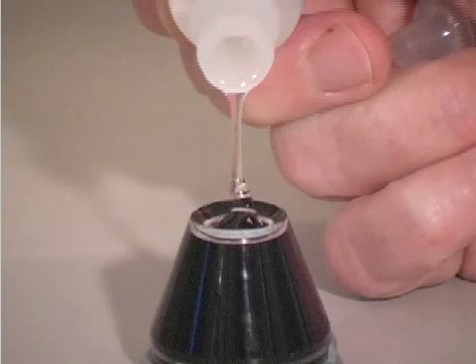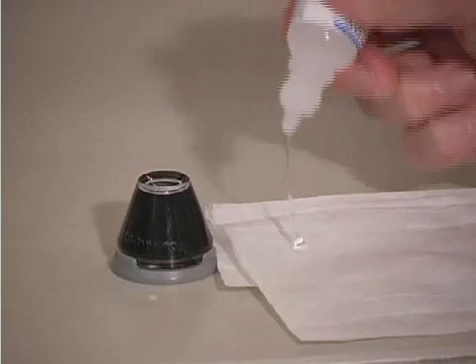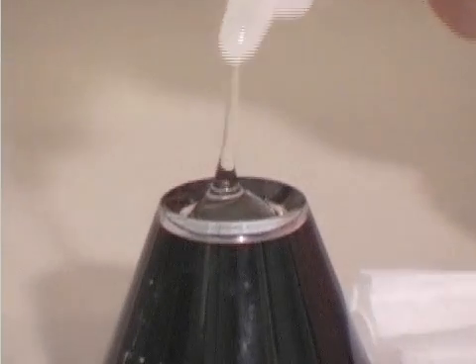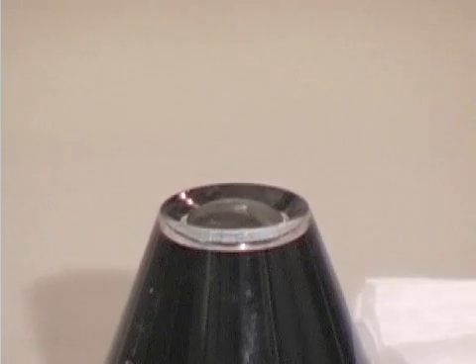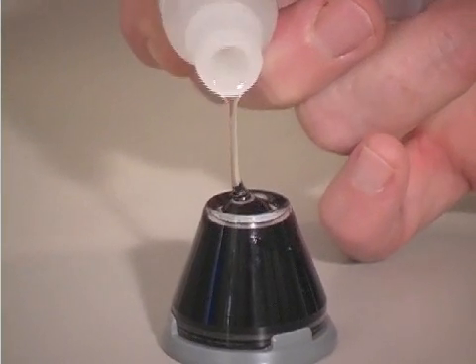One begins the examination by filling the concavity of the lens with methylcellulose. It's important that there are no bubbles in the fluid. This can be done by beginning a stream of the coupling material on a tissue and then transferring the stream to the lens concavity. Alternatively, one can remove the dropper cap and deliver a glob of methylcellulose into the lens concavity.